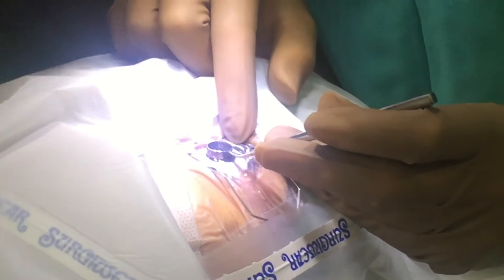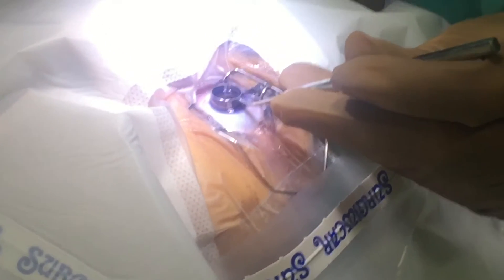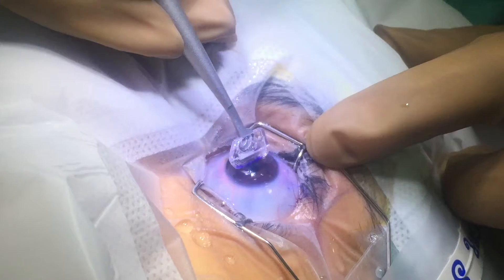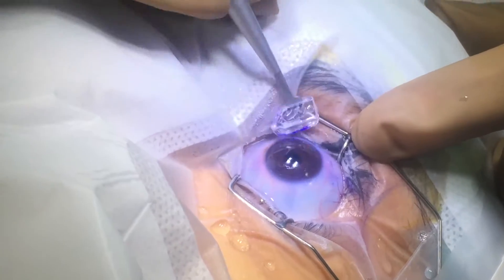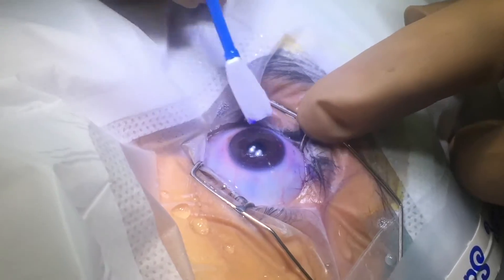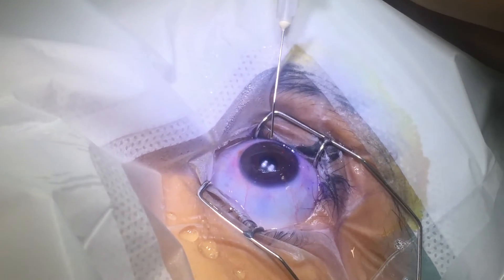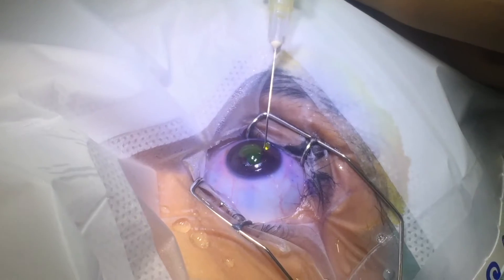In collagen cross-linking, first the top epithelium layer is removed. We use a ring on the cornea and apply diluted alcohol to loosen the epithelium — the top surface. By removing this epithelium, we expose the inner layer, which is the stroma of the cornea. This stroma will then be exposed to riboflavin dye, which gets absorbed by the collagen fibers of the cornea.